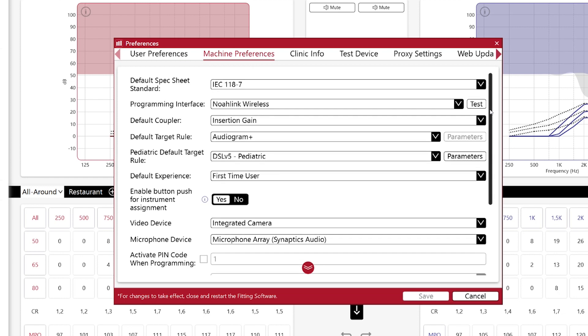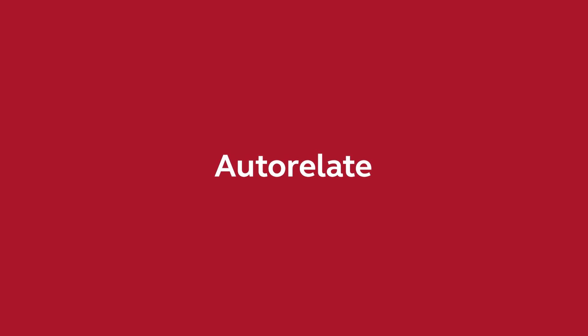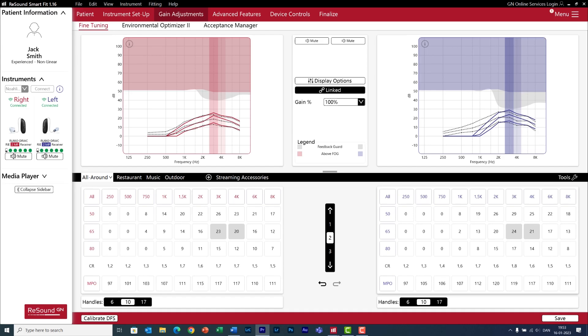And in machine preferences, you can select, for example, your default target rule for both adults and pediatrics, as well as the default experience of your client during a first fit. And remember to restart the fitting software for all your changes to take effect.